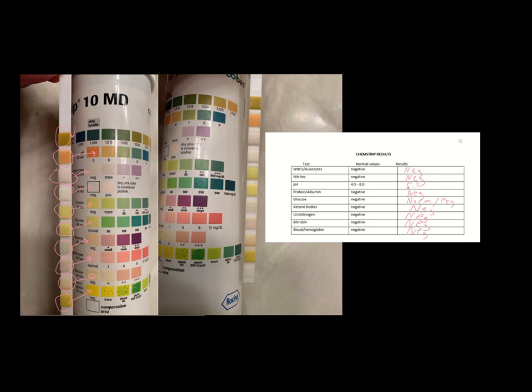But let's go ahead, and even though it's not on this chart, let's add it in. Let's add in specific gravity, since we can't do the measurement with the refractometer, and it looks like it's going to be down towards the other end, so let's use this side. It looks about right there. Now the refractometer is a lot more specific.